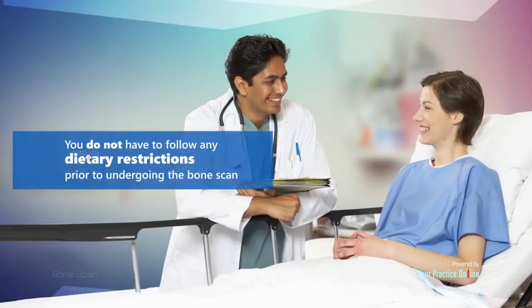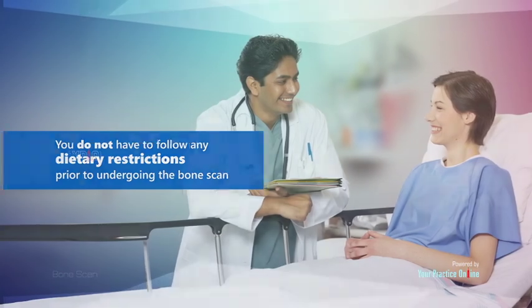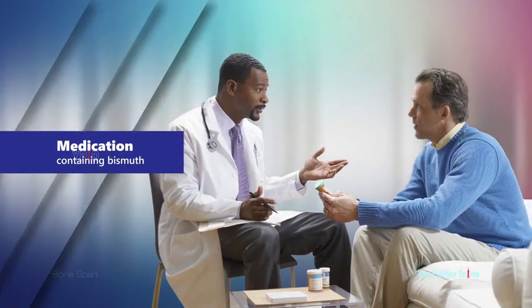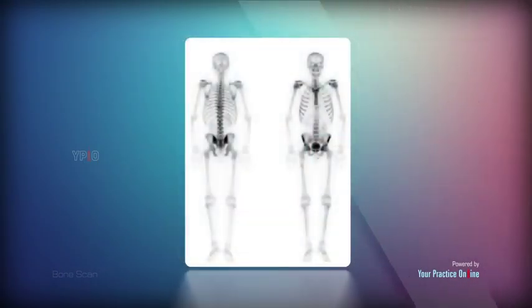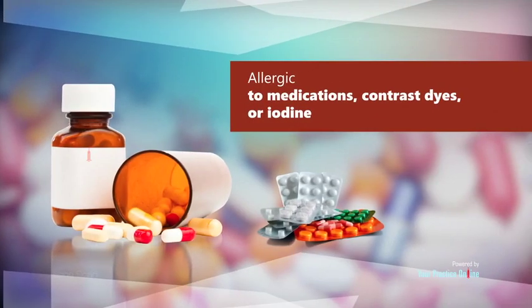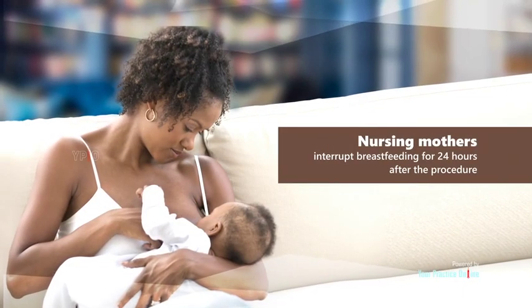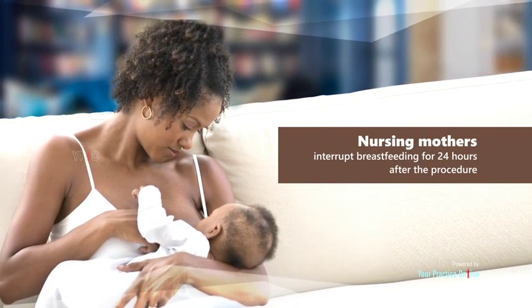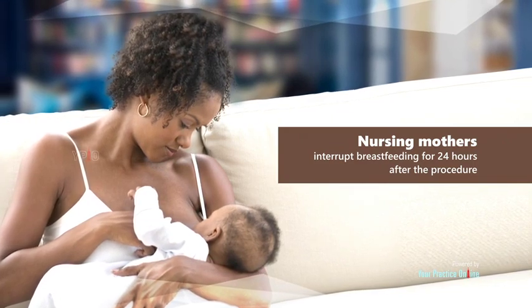You do not have to follow any dietary restrictions prior to undergoing the bone scan. However, you should inform your doctor if you have taken any medication containing bismuth or have undergone an X-ray with the use of contrast material, as this may interfere with the results of the bone scan. Also tell your doctor if you are allergic to medications, contrast dyes, or iodine. Nursing mothers should feed their baby right before the procedure and then interrupt breastfeeding for 24 hours after the procedure, pumping and discarding the milk produced during that period.